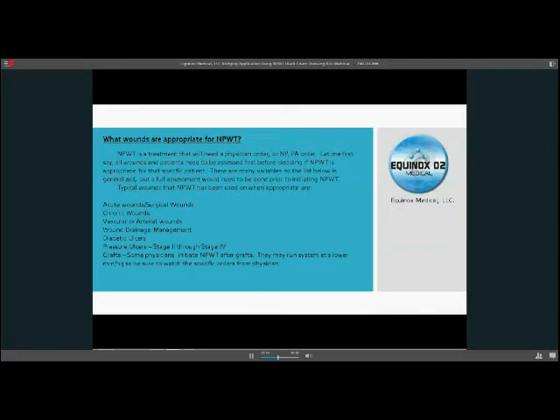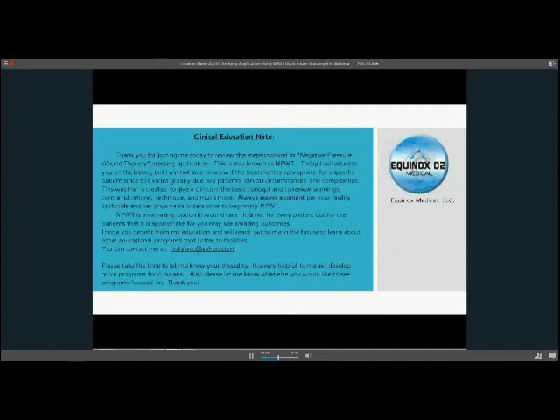Grafts, also a lot of physicians will start using negative pressure after a graft is placed. The only thing that you need to look at with that is what are the settings. A lot of times if the physician is using a graft, they'll actually decrease the settings from 125 to maybe around 80, somewhere around that, so there's not so much pressure to the graft site. And again, that would be up to the physician.